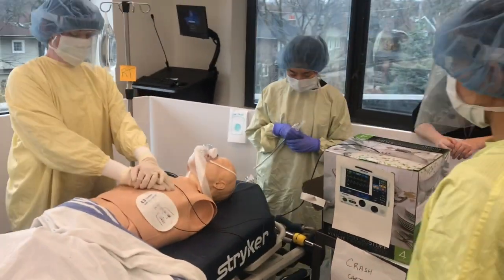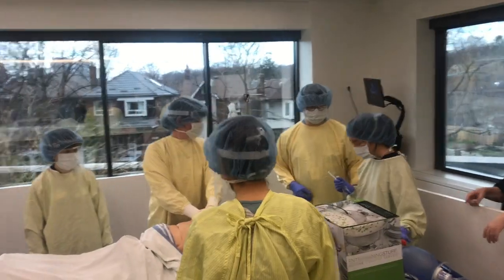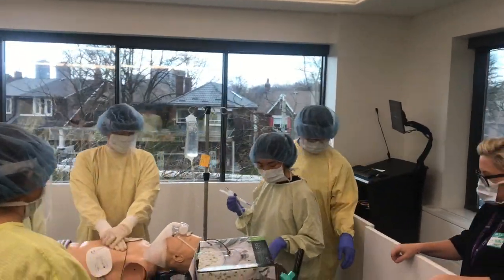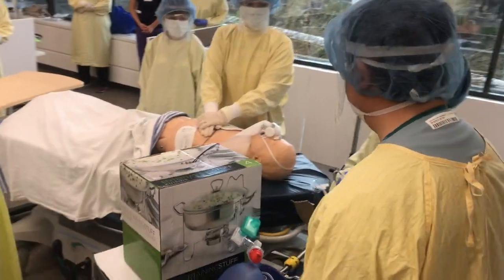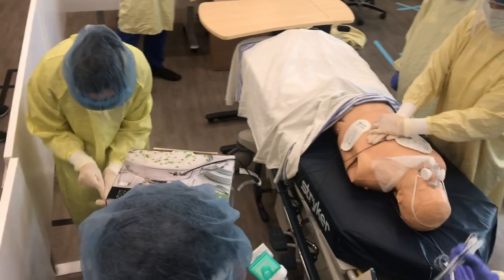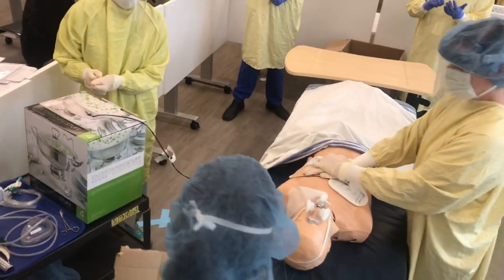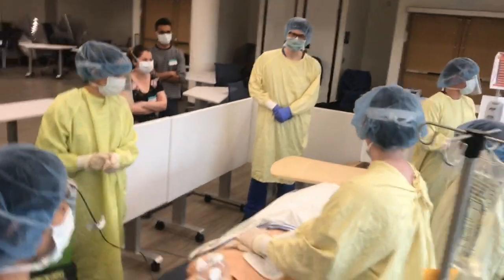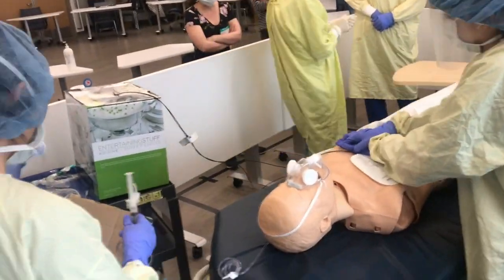So typically in an ACLS approach, the airway has really been de-emphasized. Quality compressions and early defibrillation are what is stressed. In a code blue special or protected code blue, intubation early on is very important, and that is largely for provider safety, because once the tube is in, the cuff is up, and a viral filter is on, the airway, which is what is doing the aerosolization, is sealed off from the providers.